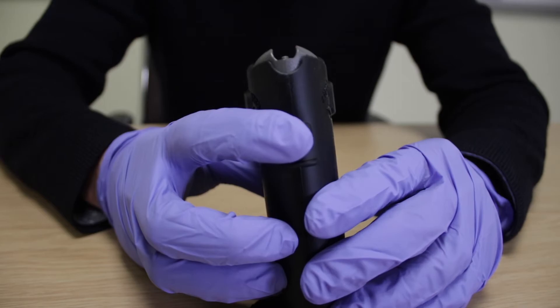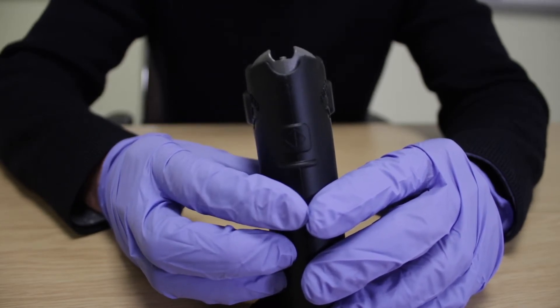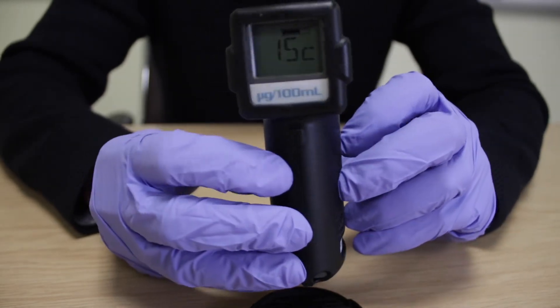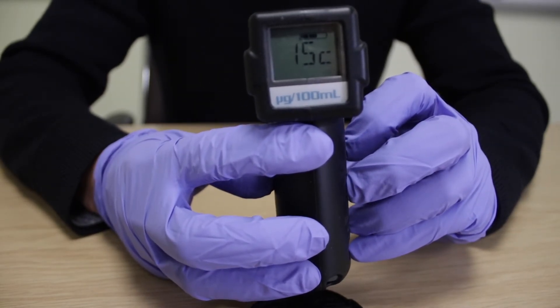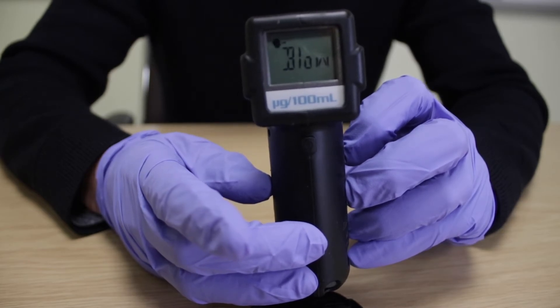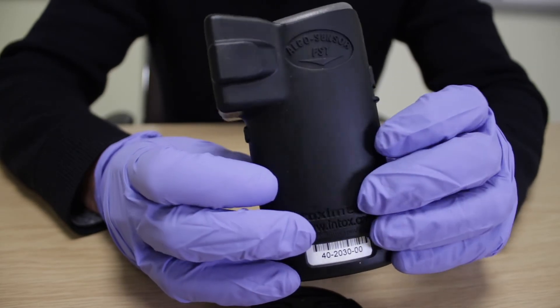On starting the device, the FST will start the air blank procedure. This checks the device's sampling chamber for traces of alcohol from any previous test, and then shows 'BLOW' with a head flashing in the top corner. This indicates the device is ready to take a direct breath sample.